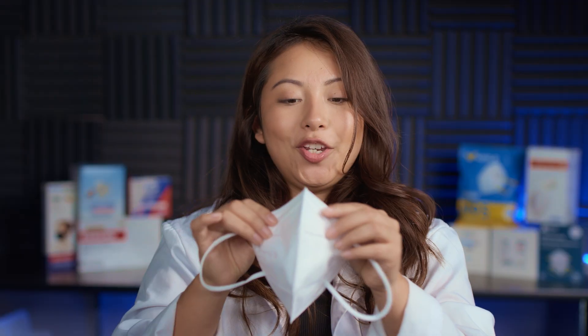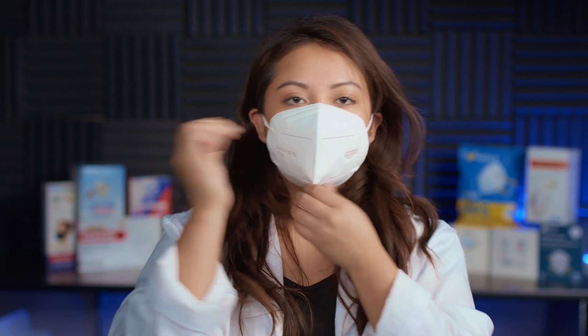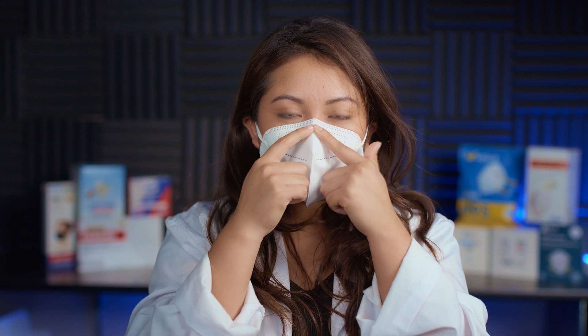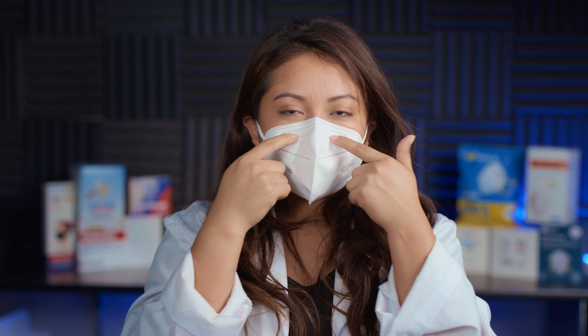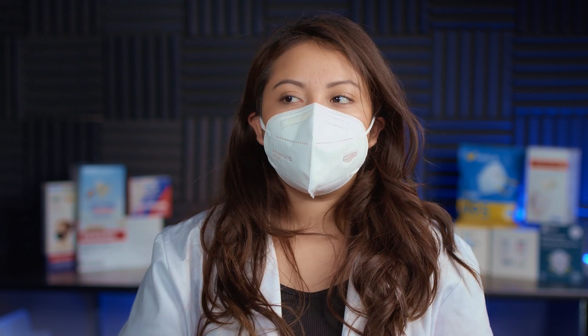I got a new one and I'm going to go ahead and try it on really quick so we can see how they fit on my face. One thing I also want to point out is that the nose wire is a little flimsy. These do have a very strong chemical smell. I am having some trouble adjusting this nose wire to my face, but this is how they look — I do feel like I am getting a good fit.